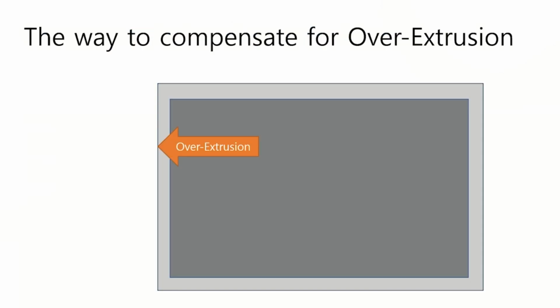In this section, we will discuss a common mistake often made when attempting to solve the problem of over-extrusion in 3D printing. Frequently, users opt to reduce the exposure time as a solution to overextrusion. However, this approach may not always be the correct course of action.